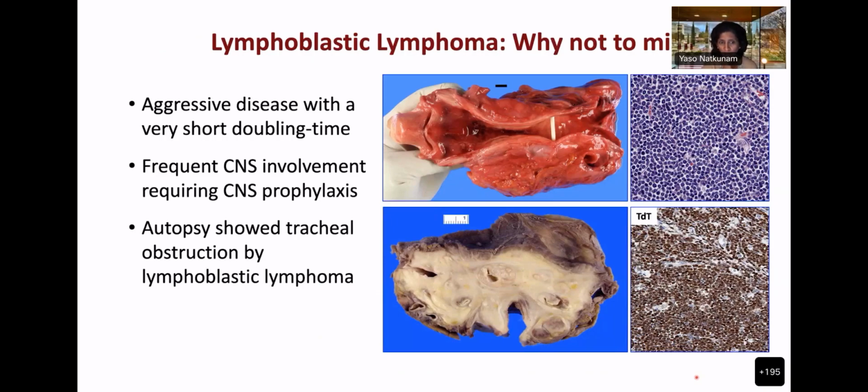For people who are familiar with and do flow, there are patterns of flow where you can look at maturation. So it's not a tight population that is expressing TDT, and a normal thymic pattern can be seen. So that can be very helpful if you have flow. If you don't have flow, morphologically, and if you're only looking at a few cells on a slide, you cannot be sure what it is. And the same markers will be expressed.